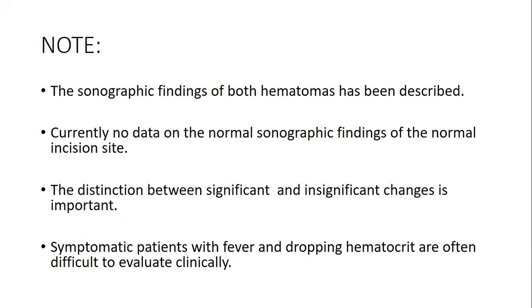So why sonography, and why should we talk about sonography? Sonographic findings of both hematomas have been described in most of the books, but currently there is no data on the normal sonographic findings of the normal incision site. So research is being done. People are doing quite a number of research concerning this, but these are some of the few things that we can do as sonographers, as radiographers, and those of us who are practicing. I think it's something that is doable and people can assess.